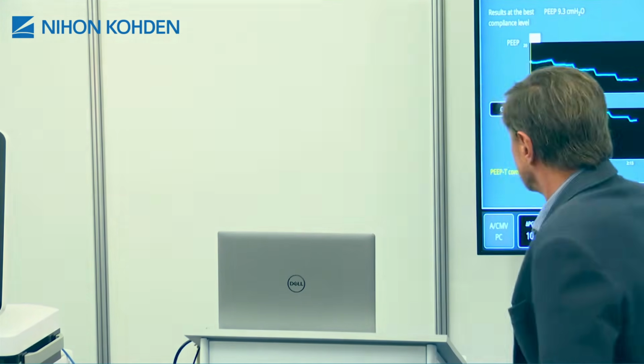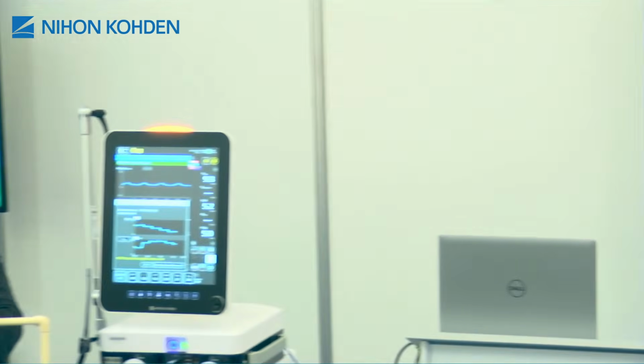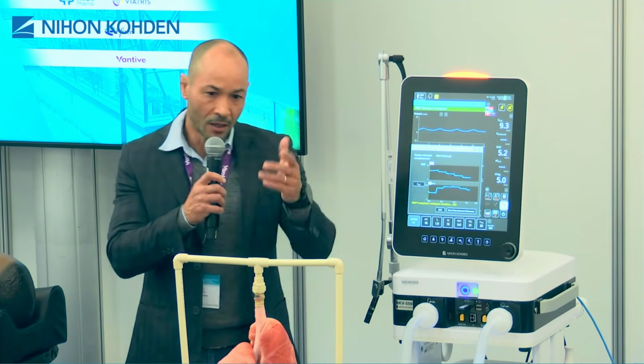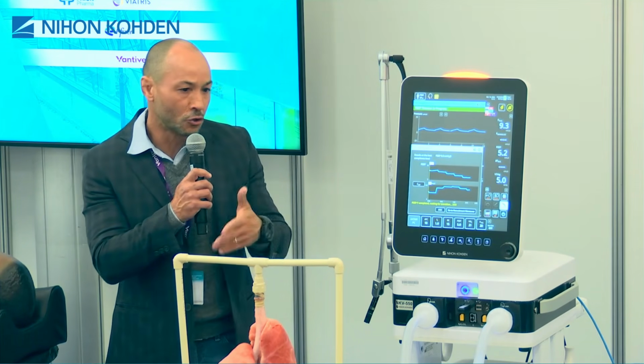Marcelo is just showing here, after the PEEP titration, the vent showed us that the best compliance here was with PEEP of 9. Okay, and then you can decide if you want to use 9, or 9 plus 2, or 9 minus 2, whatever.